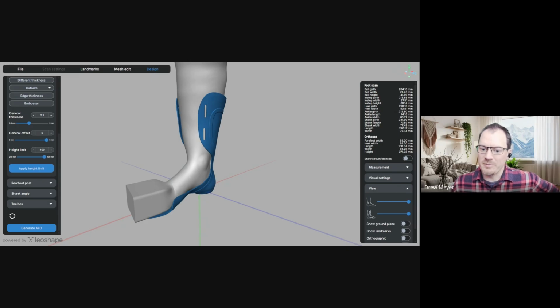All right, Sam made a nice long comment here. Give me a second to read this. When we scan the foot, we first edit the model in the software smoothing, and then we continue to the next step where we select the anatomical landmarks. However, sometimes I may apply too much smoothing. It becomes difficult to clearly identify the exact positions of certain landmarks. This led to a problem. Medial and lateral mal points were each shifted by about 1 centimeter. Interesting. Requires remaking. Unfortunately, that's too bad. For this reason, it would be extremely helpful if the scan edit section included original reference markers or guides.